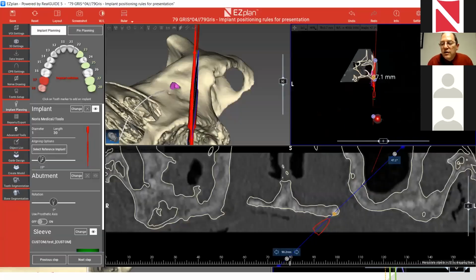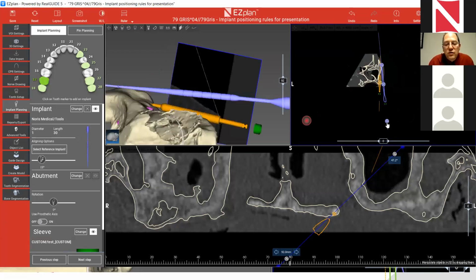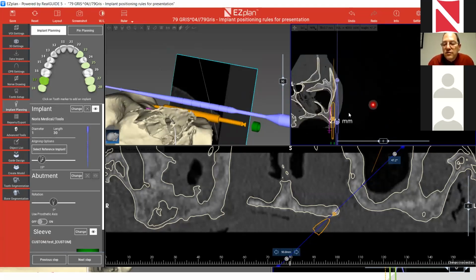Now I want to see. I want it from this angle. I'm here, looking from the side. Okay, looking from the side. I will bring the tool until I'm parallel. You see, I'm bringing the tool until I'm parallel. You see this distance here, and then I'm parallel. And now I have to remember, or measure, if this is a distance I wanted or not.